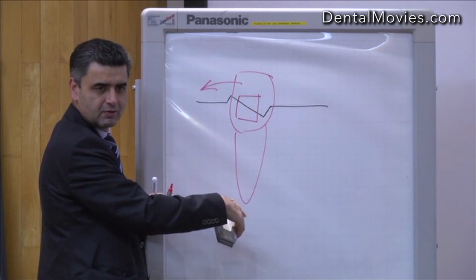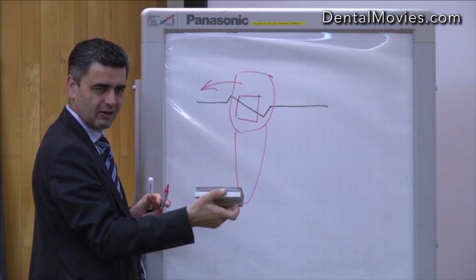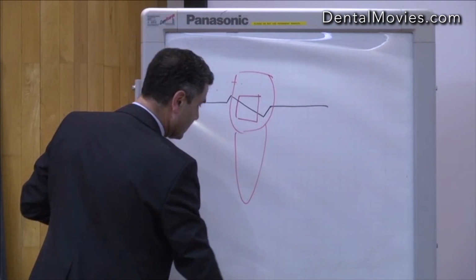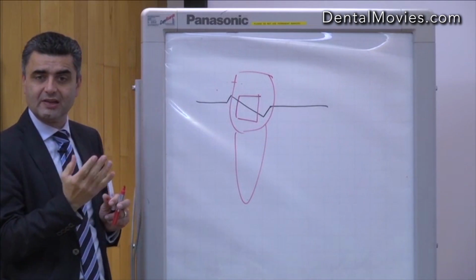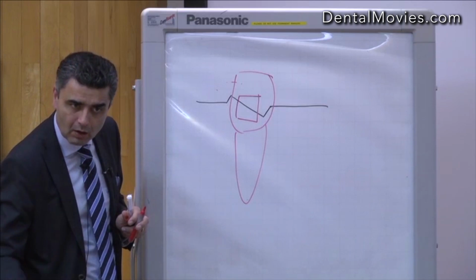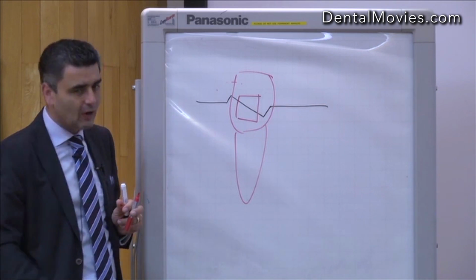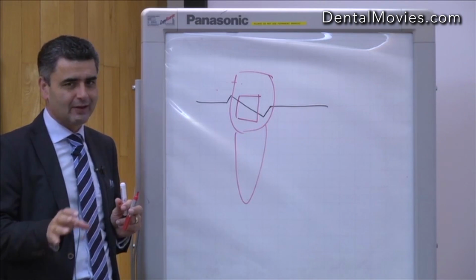look at the root. Or you visualize the root, but you're not going to see it. So what you've got to remember, wherever you want the crown to tip is going to be the low side of the bend. Write that down, because I can see everyone going.